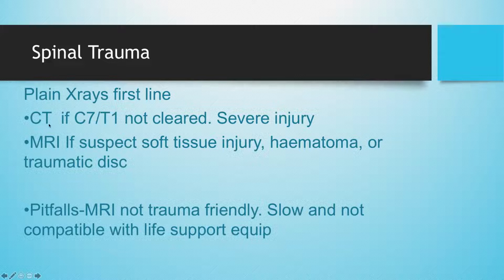And you all will learn, you did your X-rays and the patient has a serious, particularly a high-speed injury, and we can't see the C7-T1. Sometimes we'll go on to the CT, especially if the patient is having CT for something else. But sometimes we get a shopping list kind of approach, and it's not generally very helpful because usually the patient can cooperate sometimes without a whole lot of X-rays. Nothing really wrong with them.